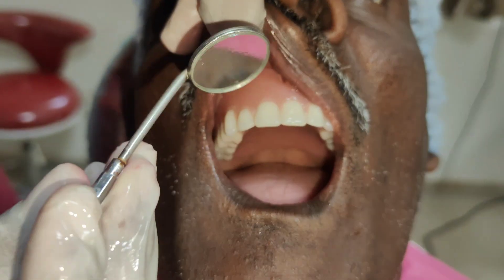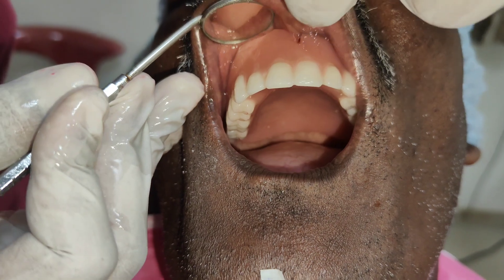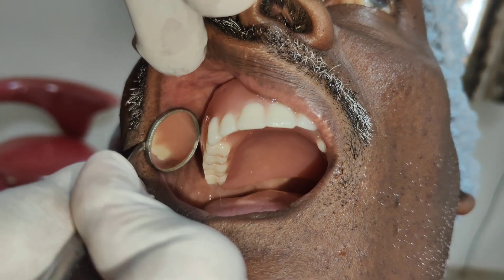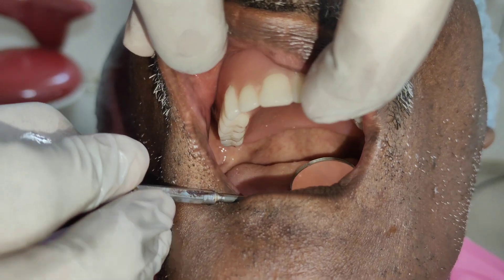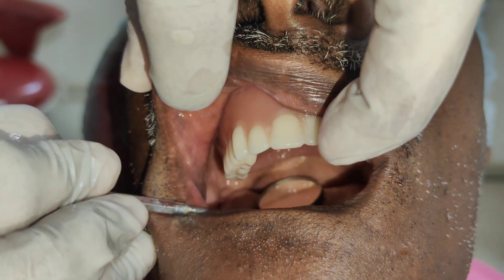The peripheral adaptation of the maxillary denture is checked by placing the mouth mirror at the junction between the denture base and the mucosa. It should be checked all around over the labial mucosa, on the labial vestibule, buccal vestibule, and also in the posterior palatal seal area. The patient is instructed to say 'HA' several times.